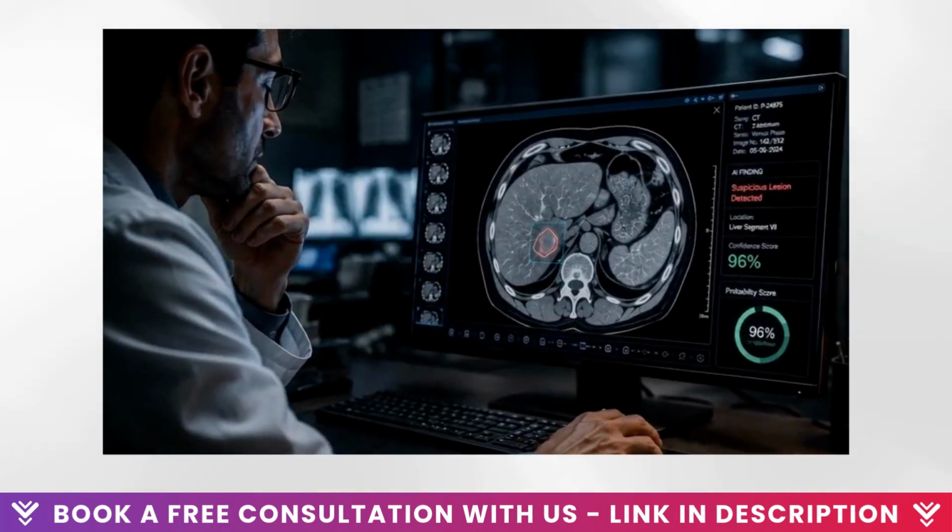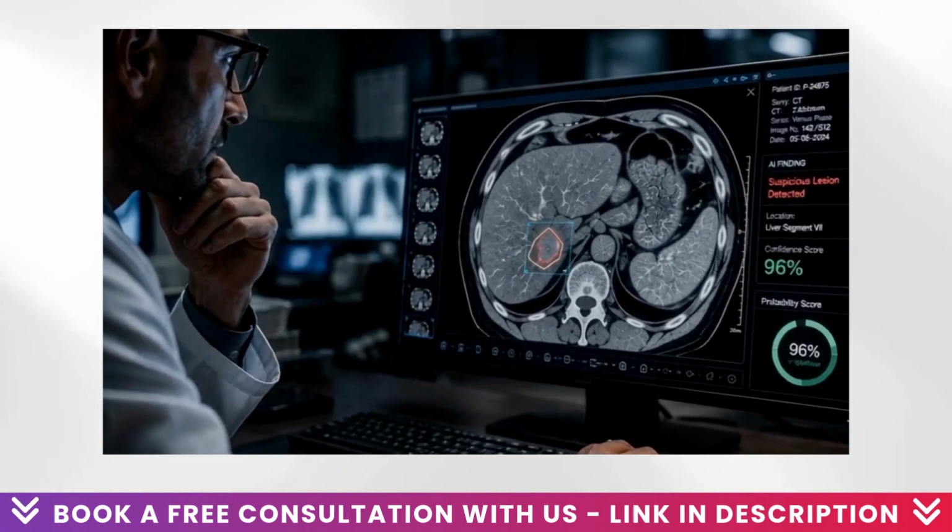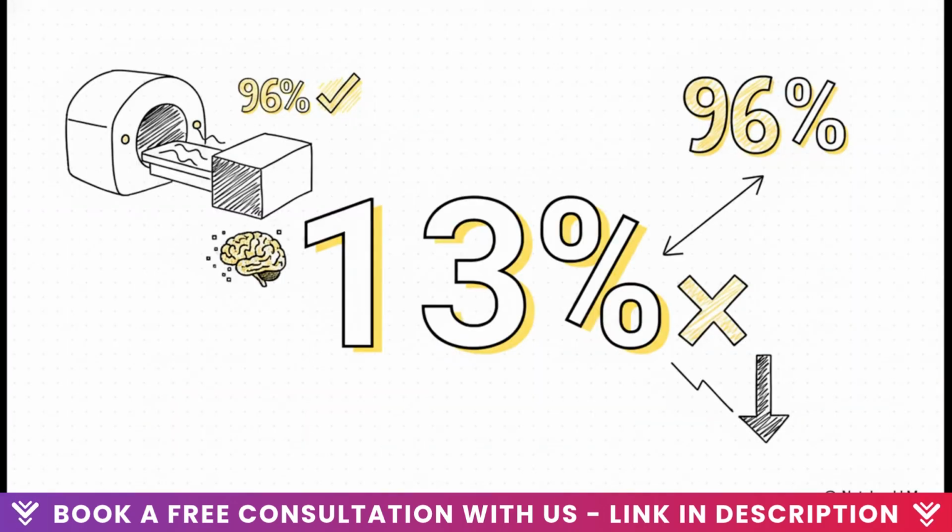It is a meticulous and, honestly, an incredibly vital process. But before we look at how we build these systems, we really need to understand why they have to be built so rigorously. 96% to 13%. In a recent study, researchers took a highly praised, super sophisticated deep learning model called VGG16. Now, on clean, normal MRI data, it achieved an incredible 96% accuracy. But when the researchers introduced specific adversarial attacks, these are tiny, almost completely invisible mathematical alterations to the image pixels, the model's accuracy absolutely plummeted to a terrifying 13%.